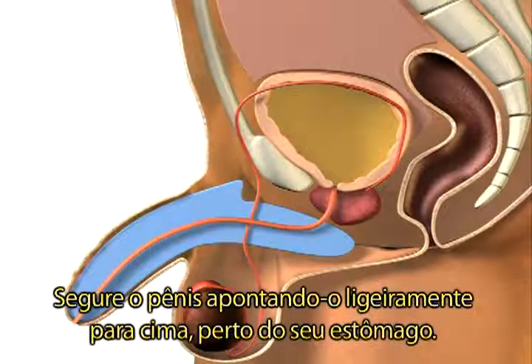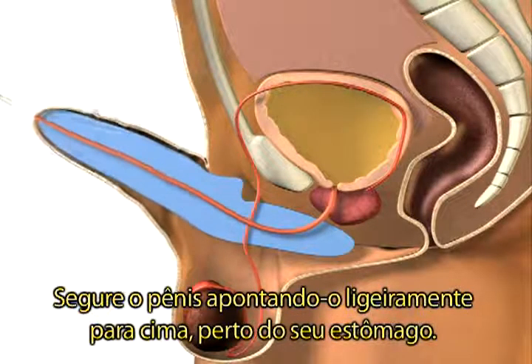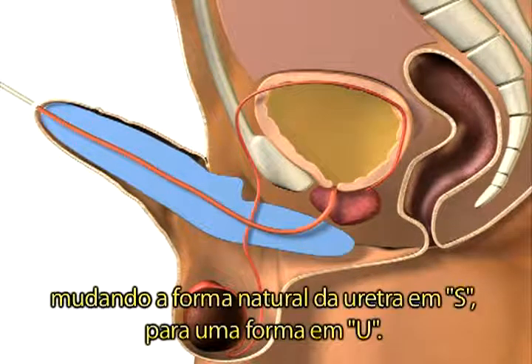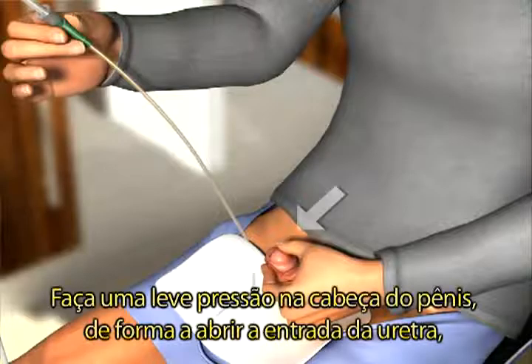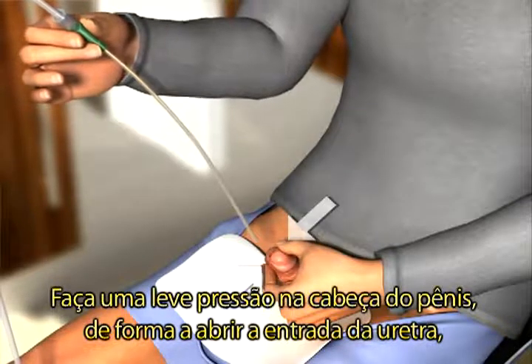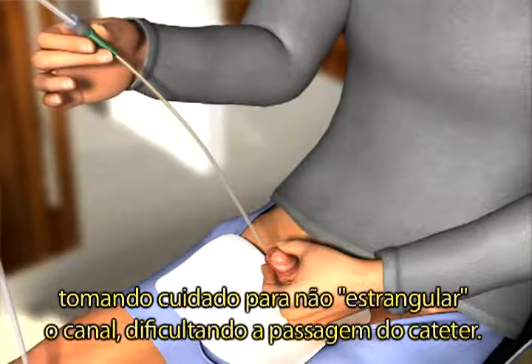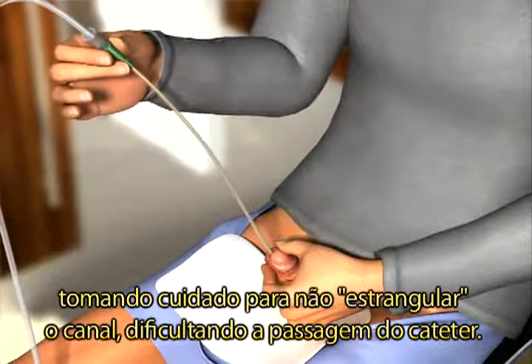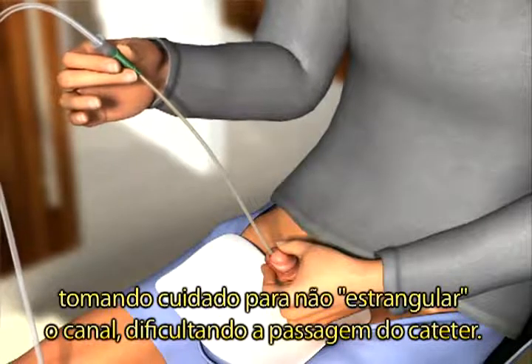Hold your penis pointing upwards and close to your stomach. This will ease the insertion of the catheter as the natural S shape of the urethra is changed into a U shape. Provide a gentle pressure to the head of your penis in order to open up the urethra, but be careful not to squeeze your penis as this may obstruct the passage of the catheter during insertion.